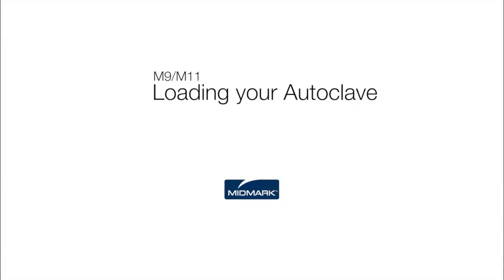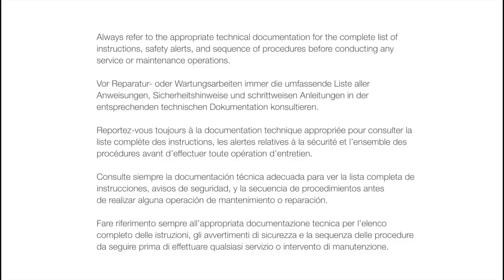This video is an overview of proper loading of your autoclave. Always refer to the appropriate technical documentation for the complete list of instructions, safety alerts and sequence of procedures before conducting any service or maintenance operations.